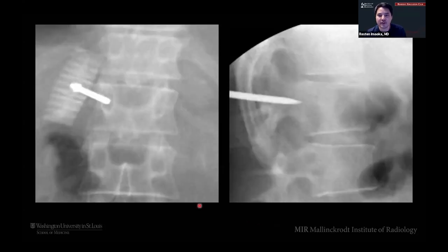As you're putting your needle in, you're going to be checking your APs a lot, right? You need to check here on your AP where you're a true AP, so you're looking at your spinous processes, where they're going to be equidistant from your pedicles on the right and left here, and you're really looking at that medial wall of the pedicle, right? So this is a nice view. We show the needles coming in, it's in the pedicle, but we have not violated that medial wall.